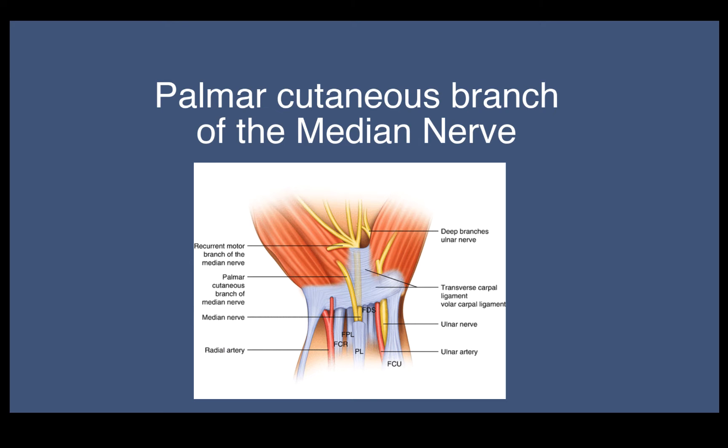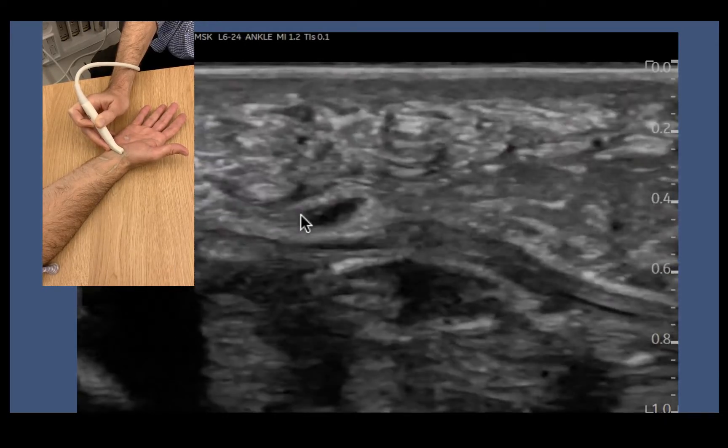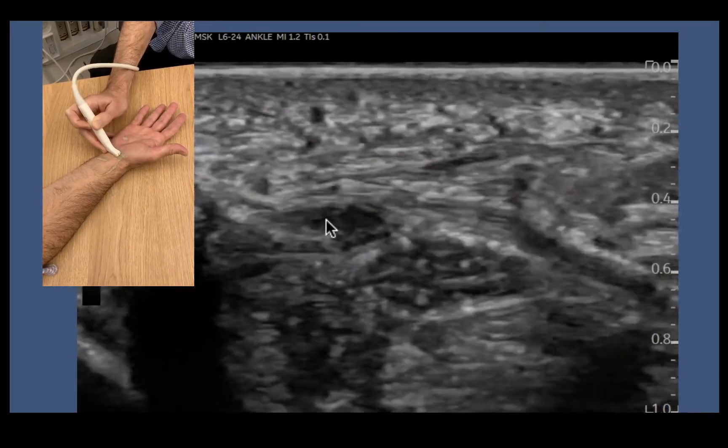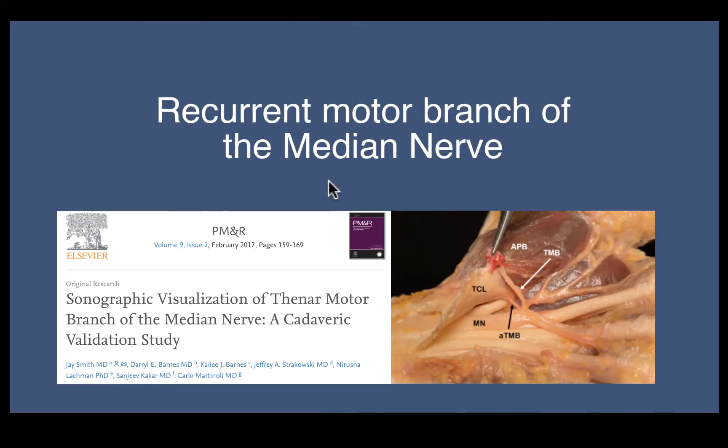So we're going to have a little look at the palmar cutaneous branch of the median nerve — one of those superficial little nerves we can see. This one here is quite thick; this is a GE employee that we had a little scan of. It's got this thick palmar cutaneous branch that runs through the transverse carpal ligament.